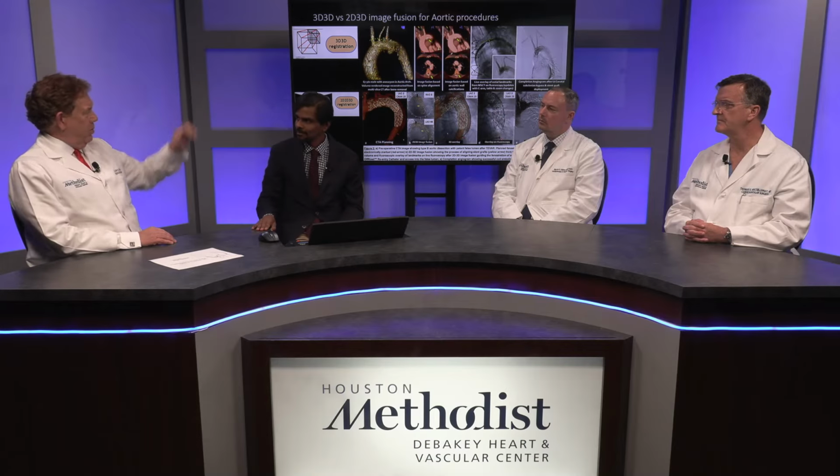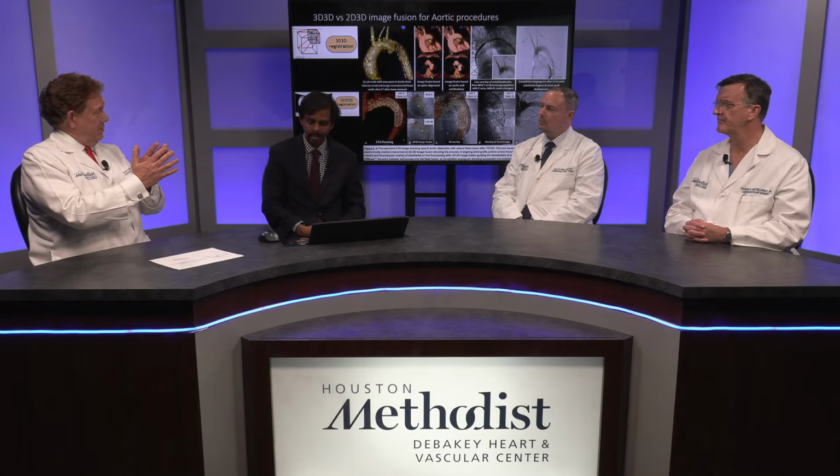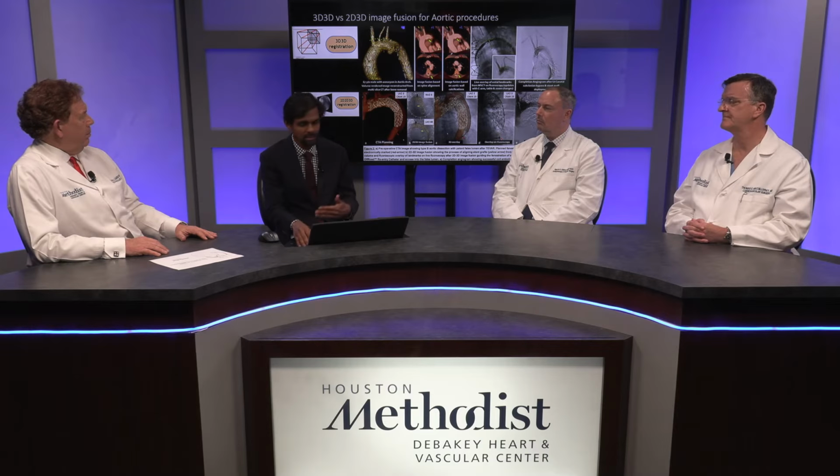Smith a month ago, and the image of the endograft you've just created, and put the two endografts together. Yes. Now you're fused. Instead of repeating another 3D imaging, because we have the hardware, we can do that. So what if there is no endograft, and if we want to do 2D, 3D registration?